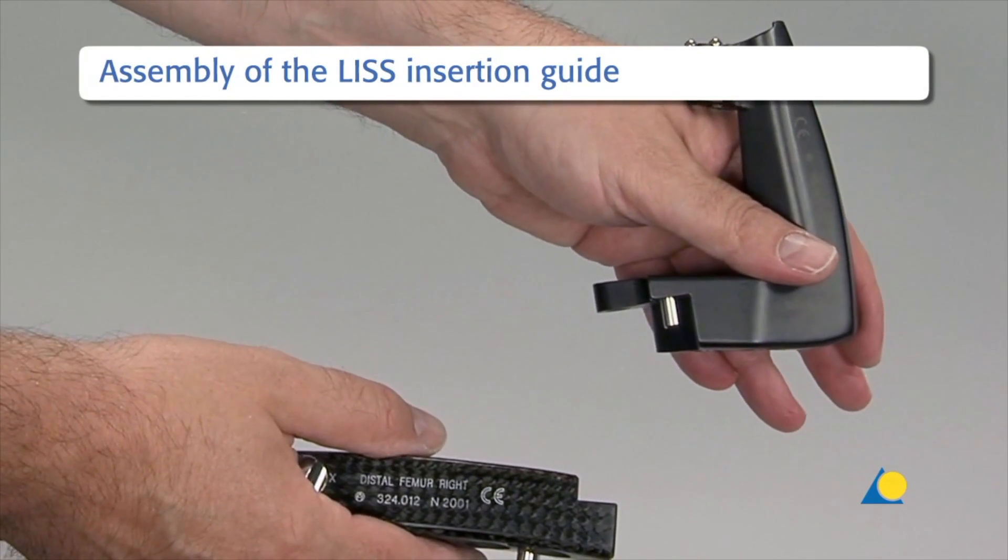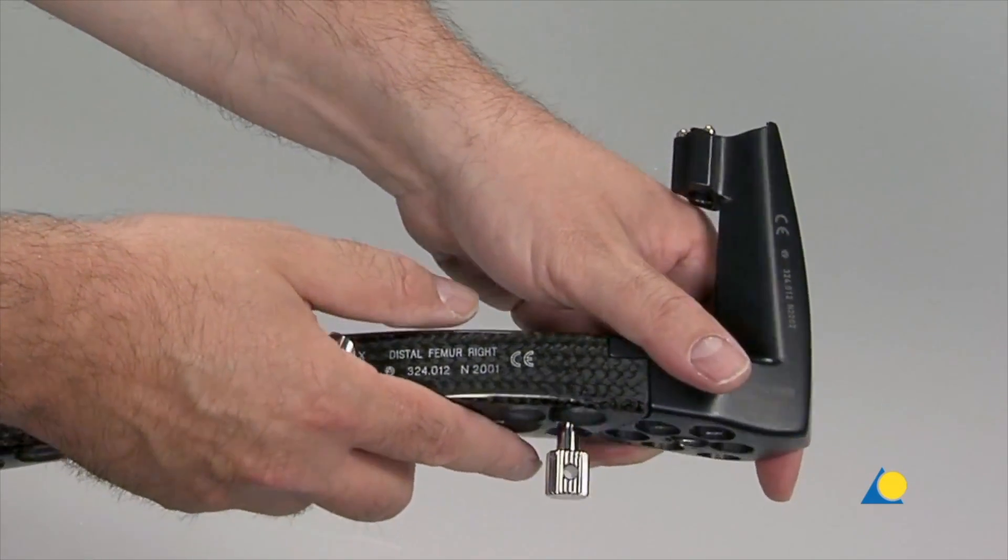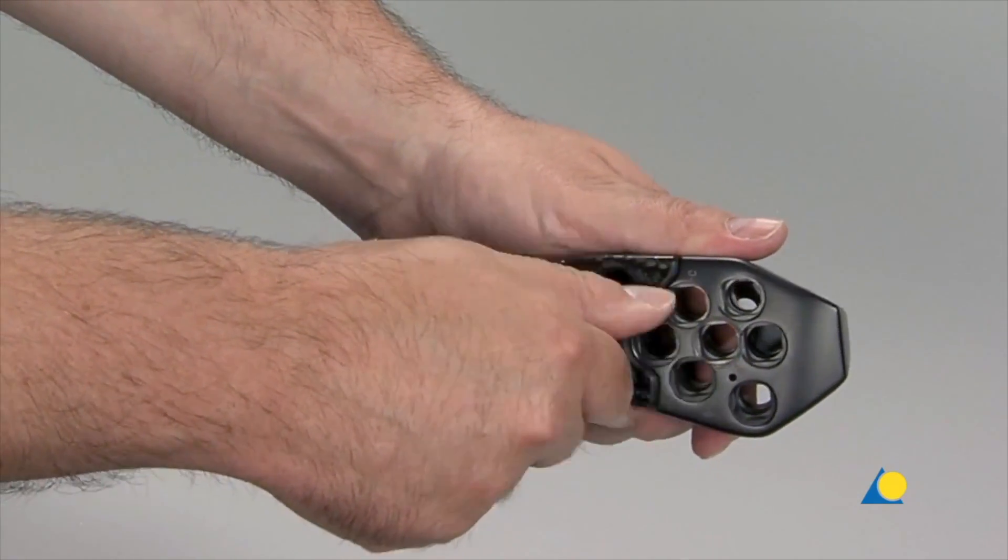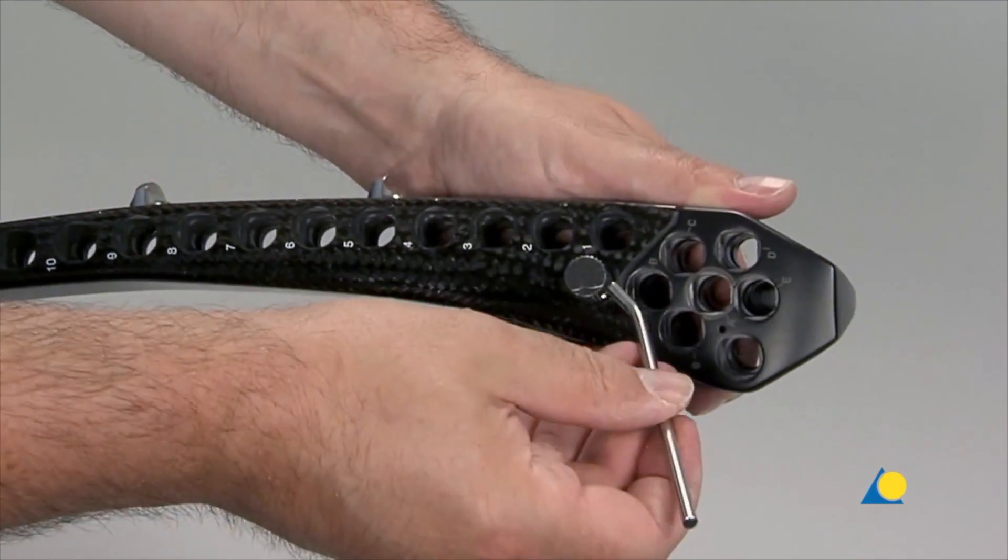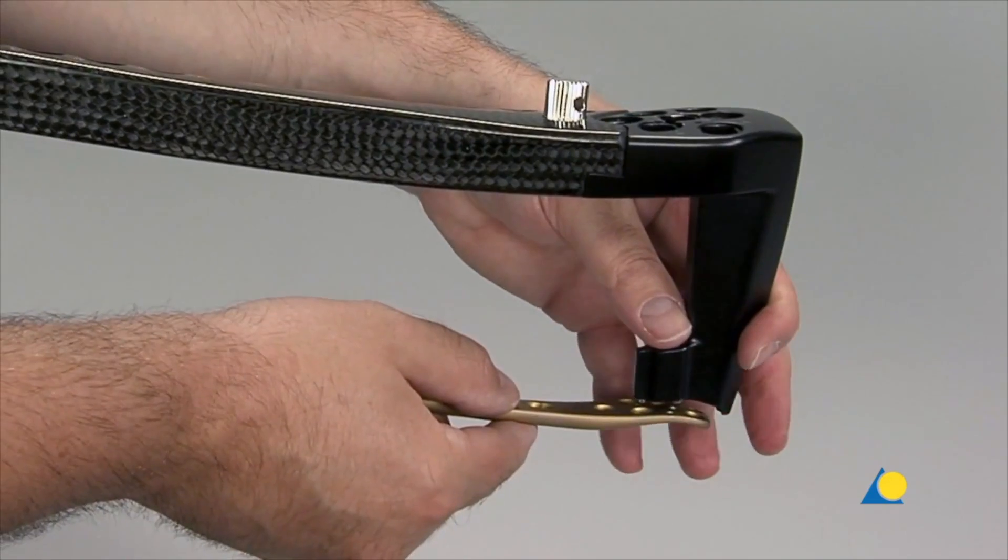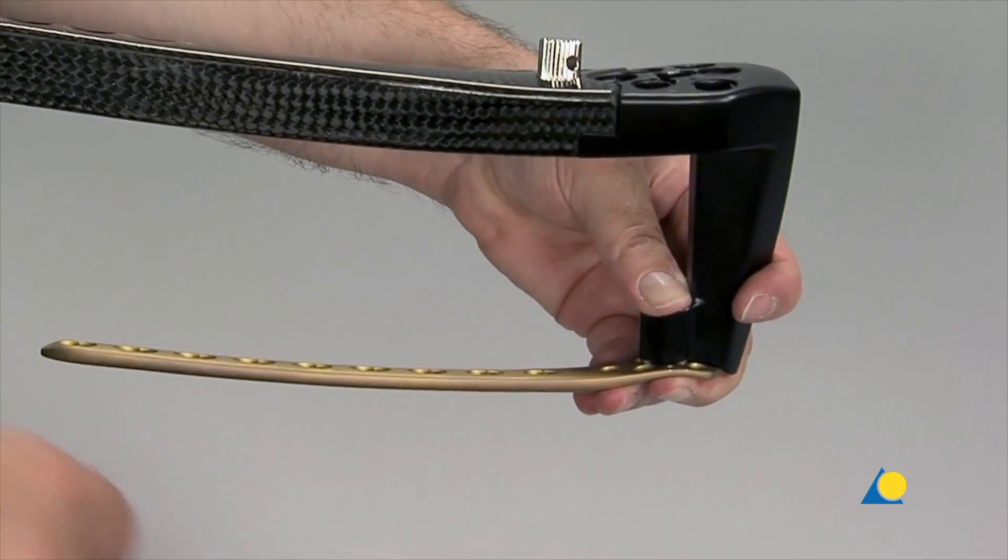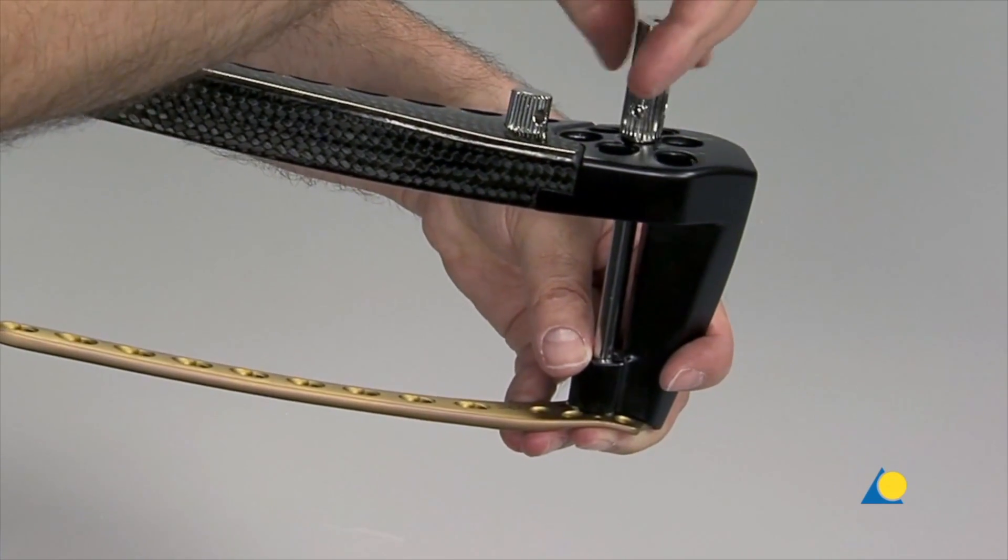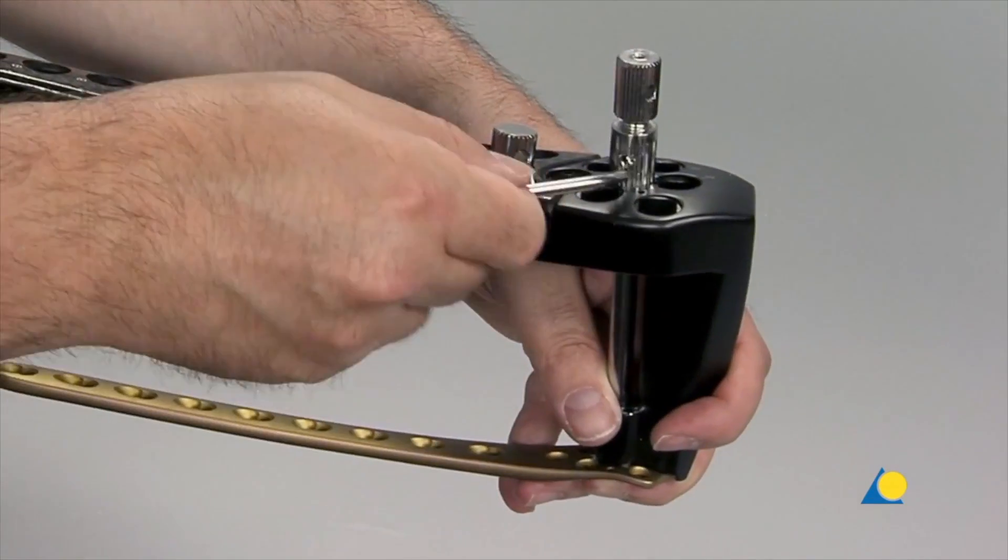The main component and the radiolucent extension of the distal femur LIS insertion guide are assembled. The nut on the extension is tightened, first by hand, and then with the pin wrench. The insertion guide is fitted onto the distal end of the LCP-DF plate by means of a three-point fastening. The fixation bolt is passed through the central hole, A, of the insertion guide, down to the plate. The connection is stabilized by tightening the nut of the fixation bolt, first by hand and then with the pin wrench.